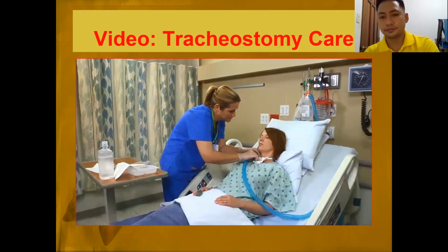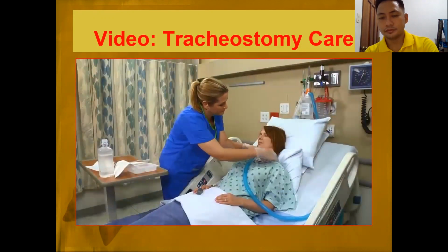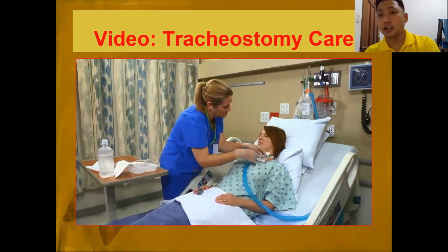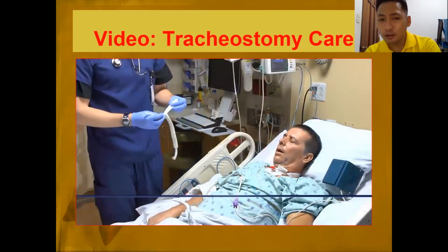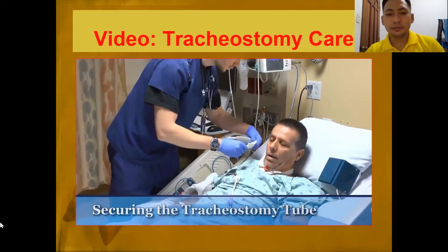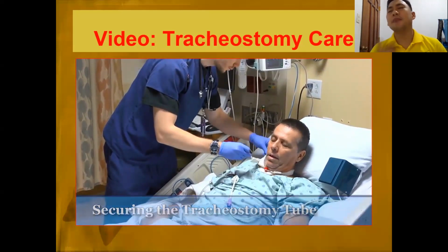Apply a new drainage sponge. The gauze used in the dressing should not be one you cut yourself, but should be pre-cut, not free cut. Pre-cut gauze intended for stoma dressing. Why is it pre-cut? So there are no loose fibers. Because loose fibers might enter the stoma, causing the lungs to become infected, or the patient can be aspirated.